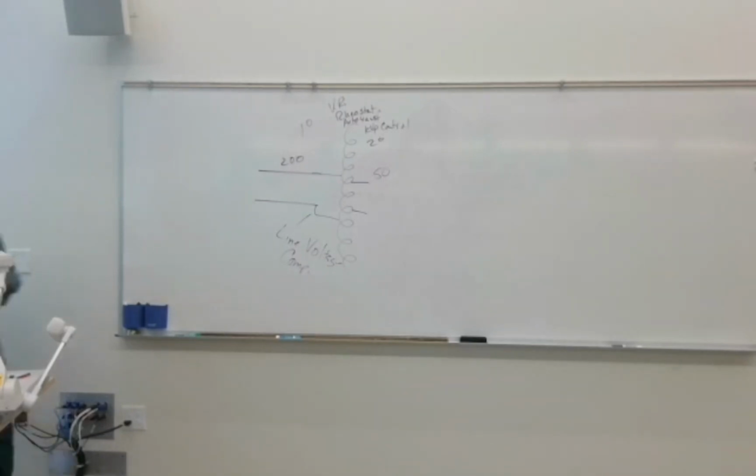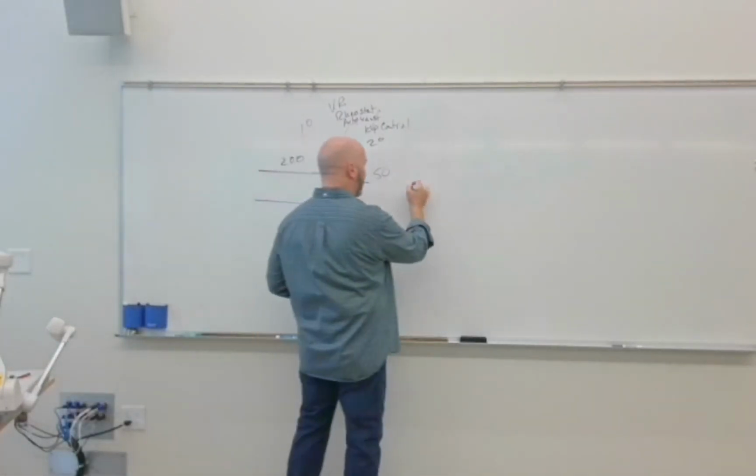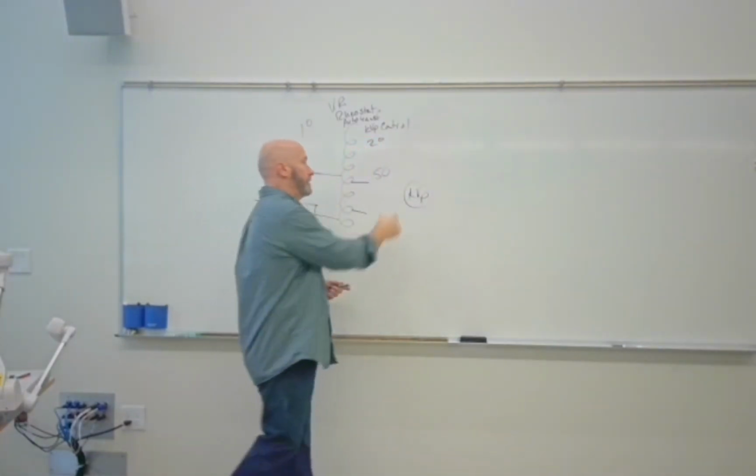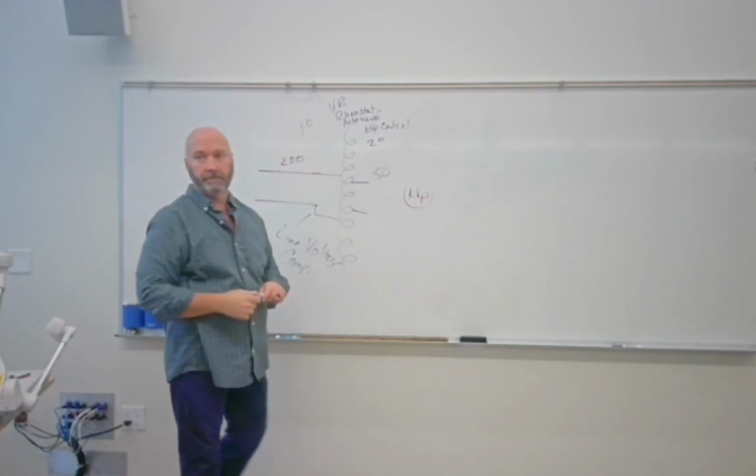All right, if you notice on this diagram on page 111, you see where it says kVp meter. You've got a kVp meter right about here. Again, is it measuring kVp? The answer is no.